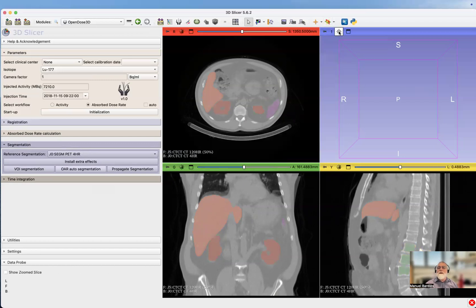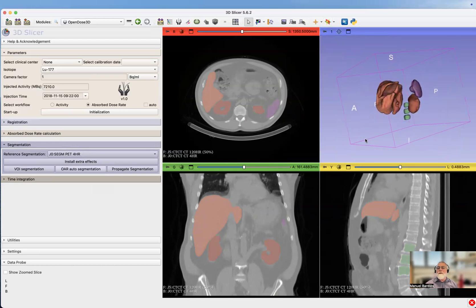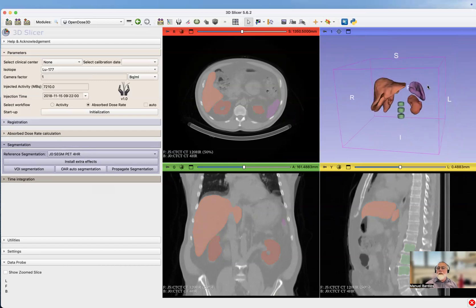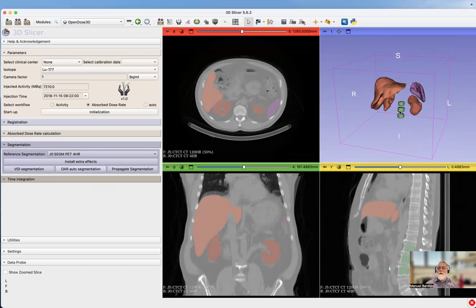If I want to have a look at the segmented organs, I just click here and you see, here we go. I've got the liver, the two kidneys, the spleen, and bone marrow that's been extracted from L2, L3, L4. We only have bone marrow here. Segmentations are fine.